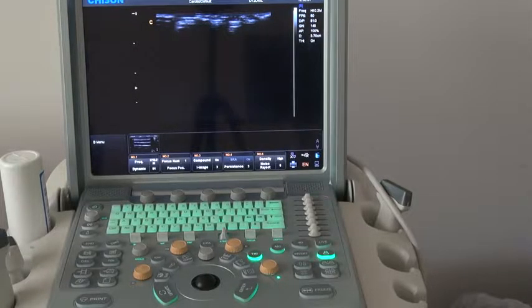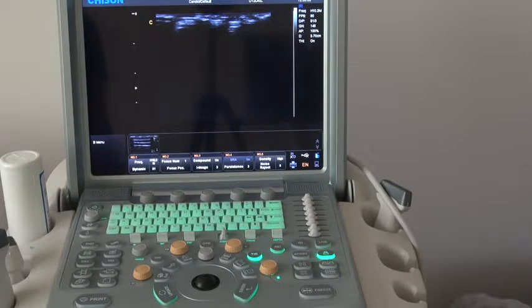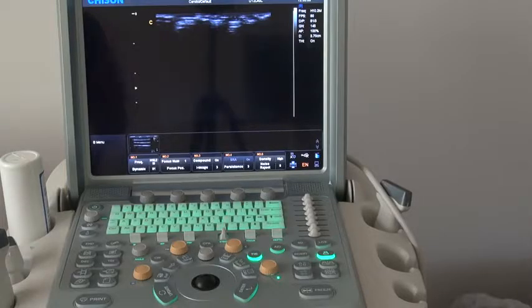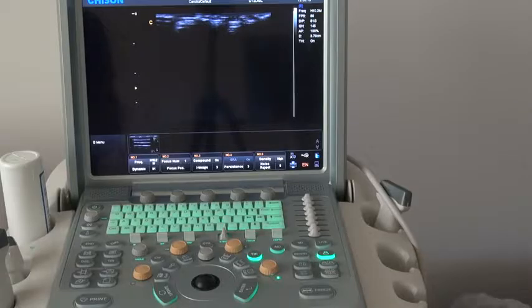Hi, this is Becky, the clinical specialist. First of all, I will show you how to open and find the cardiac functions. And next, I will show you the general operation for Q9.